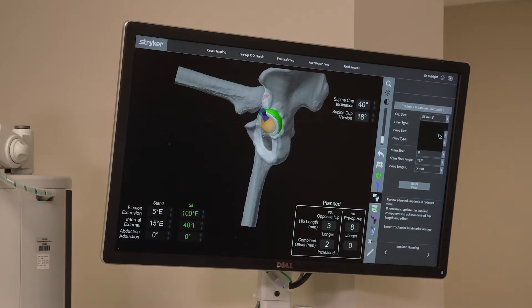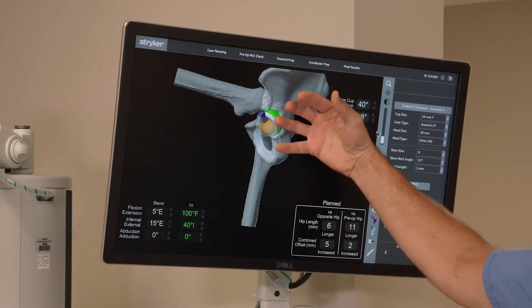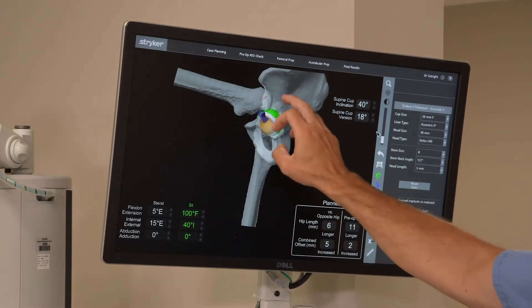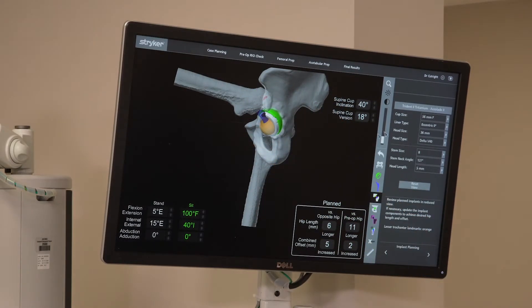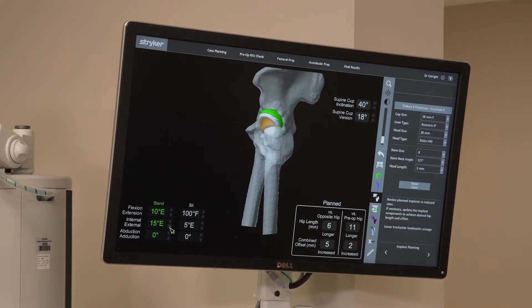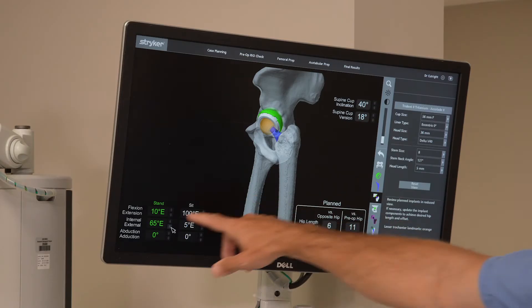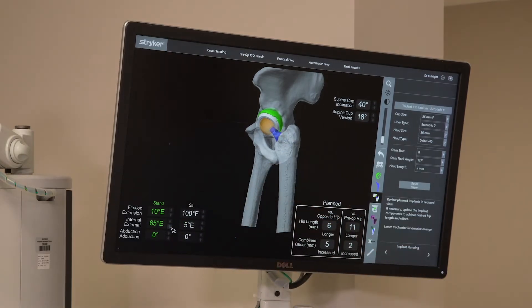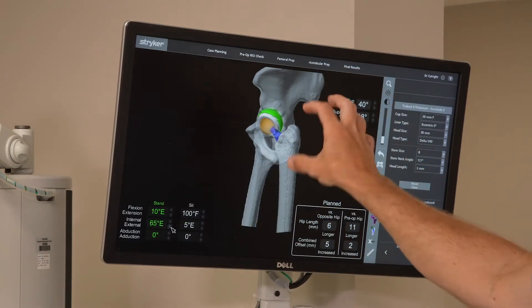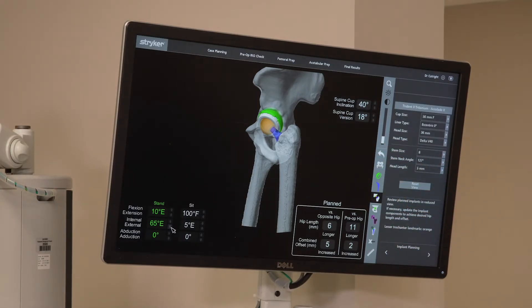So one thing I might do is switch your plastic cup. Now see how it decreased the redness — what I did is switch the plastic cup and used one that pushed the femur away from the pelvis a little bit to make the hip more stable. Then you can go to stand, go the other direction, and it's fine. You can move the leg and see how much motion you have before things start hitting each other.